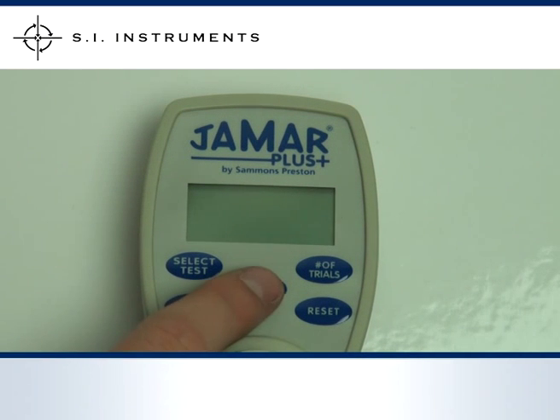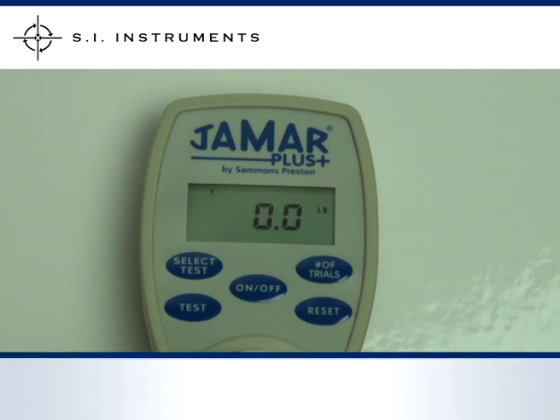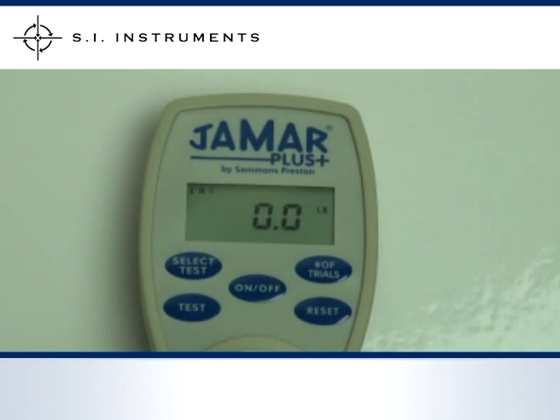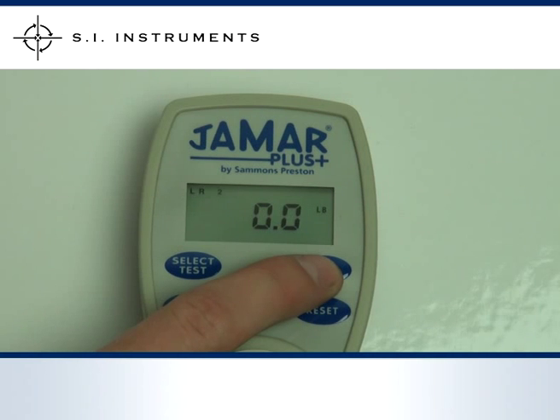Power up the J-Mart Plus by pressing the ON-OFF key. Different tests such as for the left or right hand or both hands can be cycled through using the SELECT TEST key. The number of trials can also be changed by cycling through the number of trials key.